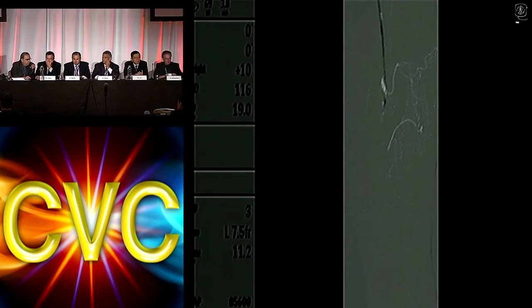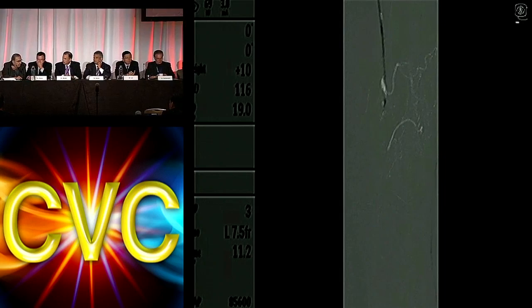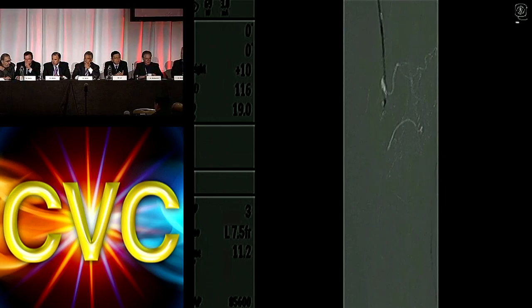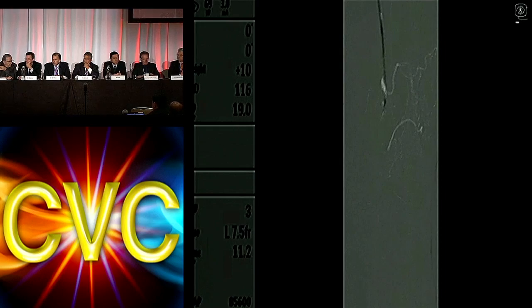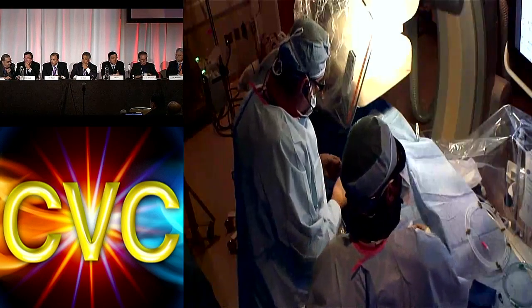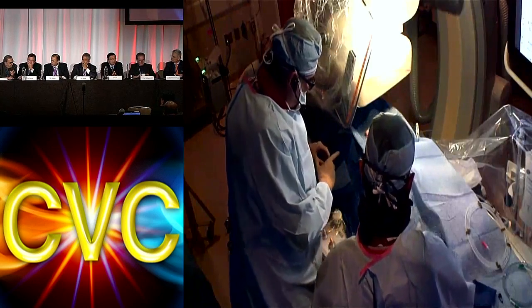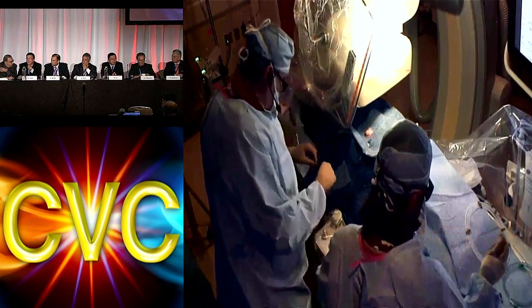But of course, I use a supporting catheter with it. As soon as I advance my wire to a certain extent, I advance my catheter and gradually work my way through the occlusion.